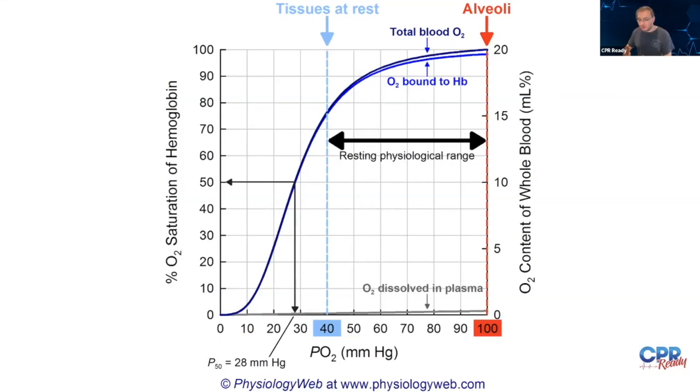So when you're analyzing your O2 saturation readings, just keep this in the back of your mind. And this will help you not only understand why a little bit of oxygen goes a long way, but also that some of our patients are right on that danger zone. And though they don't look quite that bad yet, they can crash once that demand increases. And there's lots of other things that can affect this that's way beyond what we're going to talk about today.